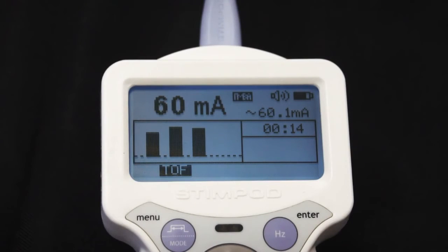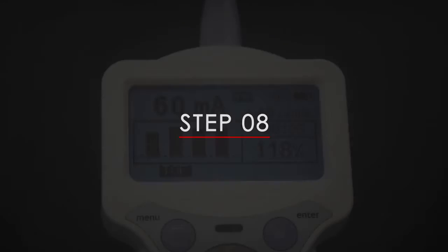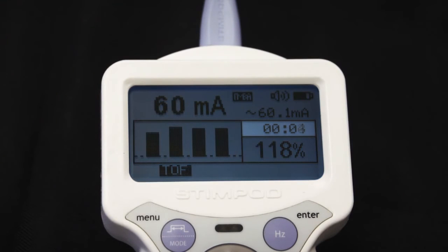Step 7: After having stimulated the nerve in Train-of-Four mode, the corresponding 4 bar graphs and TOF percentage are displayed. Step 8: Await the timer countdown of the refractory period delay before stimulating again.